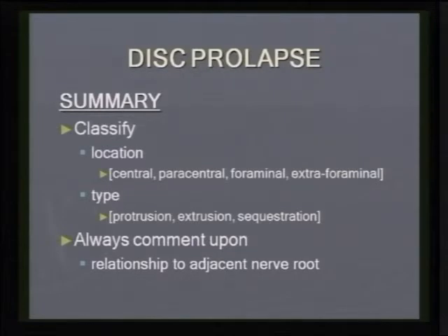So again, in summary, as far as disc prolapse is concerned, we need to classify its location into these four components, as I mentioned. Maybe describe its type, potentially not of any importance now with the relatively lack of use of minimally invasive techniques for management of disc lesions. But always comment upon its relationship to the adjacent nerve root.